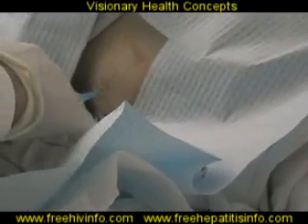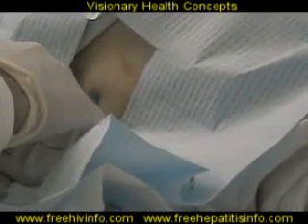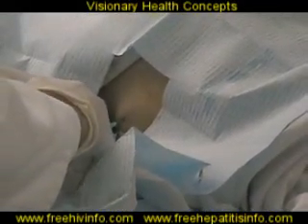A little local anesthetic, typically lidocaine, same thing we use for the dentist, is applied first into the skin and then underneath the skin to anesthetize the area and the track that the needle is going to follow into the liver. We go a little deeper with the lidocaine all the way into the liver because there are nerve endings on the capsule of the liver.